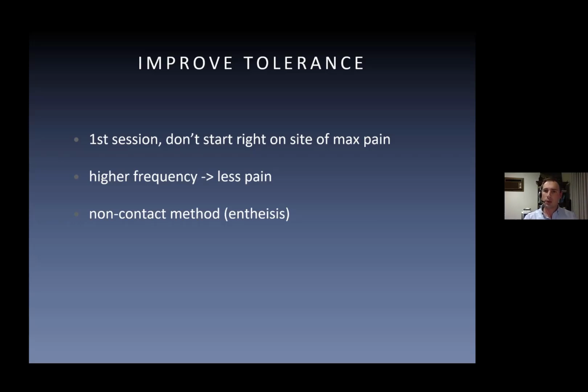Because their skin and also the applicator are both covered in gel, that shockwave is still able to penetrate, no problem, but it does alleviate the pain. So for the first minute or so, I treat like that. And then as they become comfortable, you slowly lower the shockwave applicator to their skin and they don't even notice it. So that gives you the chance to desensitize things, and it does improve the tolerance.